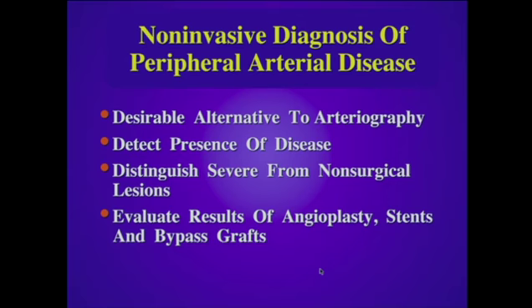Now, a non-invasive diagnosis of peripheral arterial disease is obviously a desirable alternative to arteriography. Regardless of the test you use, it should not only detect the presence of disease, but also be able to distinguish severe from non-surgical lesions. We can also use these tests to evaluate the results of treatment, such as angioplasty, stents, and bypass grafts.